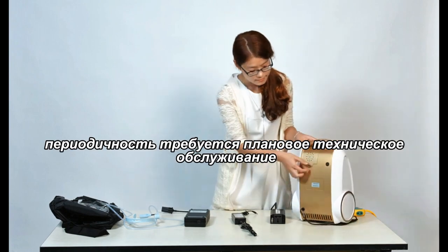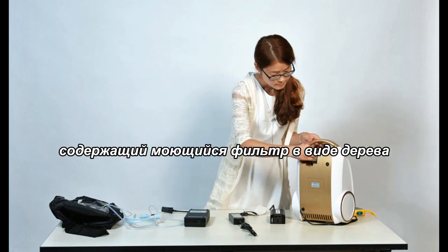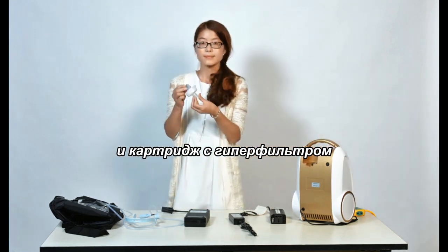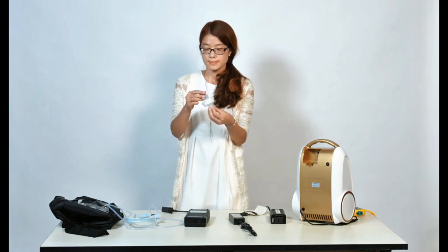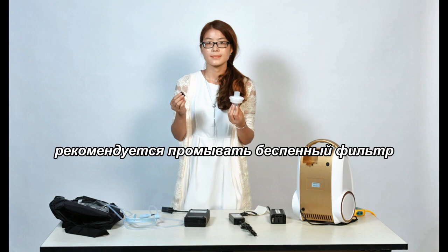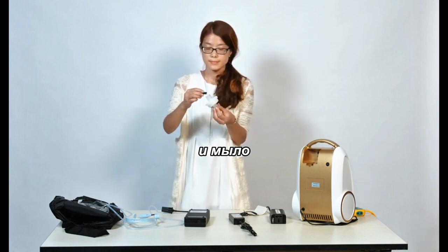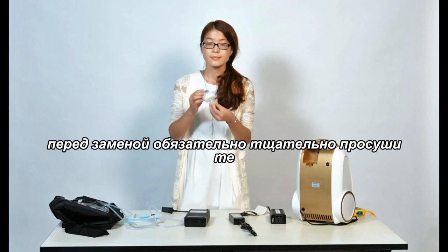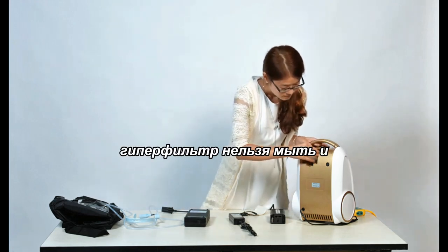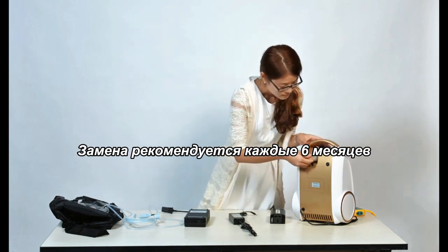Periodic routine maintenance is required. Here is the filter door containing the washable foam pre-filter and a replaceable HEPA filter. It is recommended to wash the foam pre-filter once a week in warm water. Be sure to thoroughly dry the filter before replacing. The HEPA filter is not washable and replacement is recommended every 6 months.